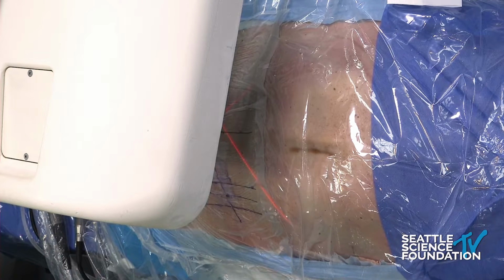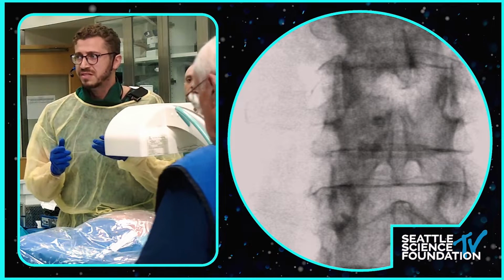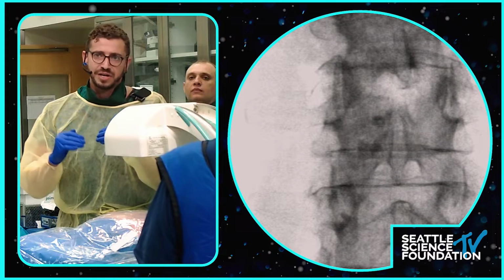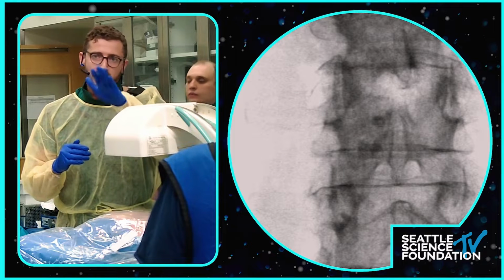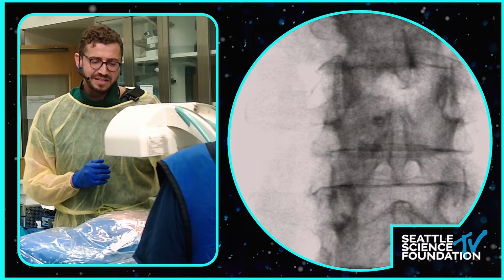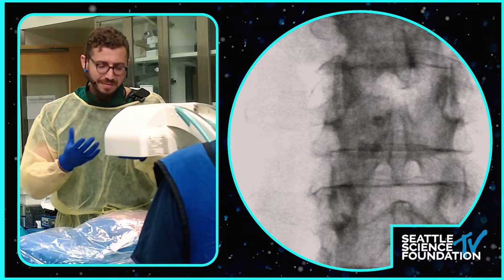Looking at that X-ray, what you want to look at on the AP is that the pedicles are perfectly bisected by the spinous process, and that the inferior aspect of the disc space is flush. So that's a perfect AP. Maybe it's a little off there, but good enough. And there are two ways of accessing the foramen: a trans-SAP and a transforaminal. They're both in the family of transforaminal approaches.